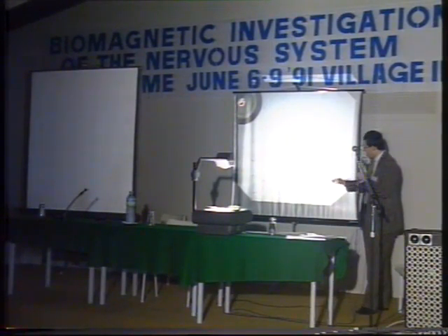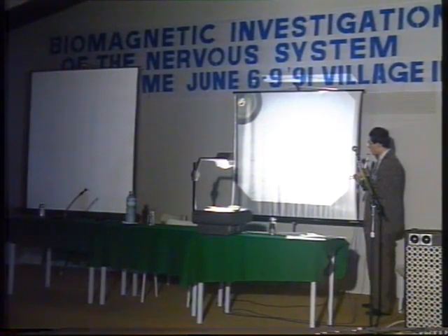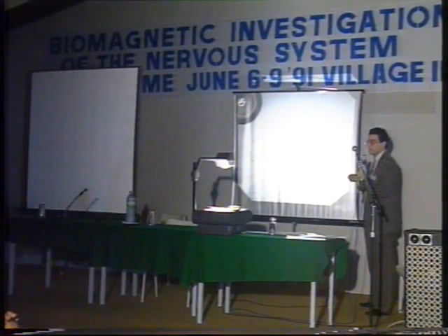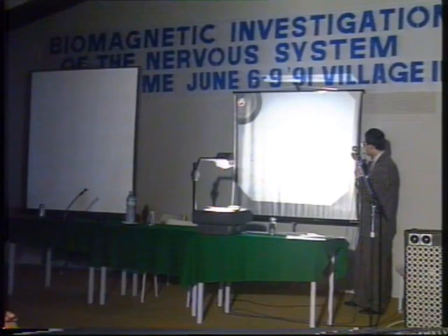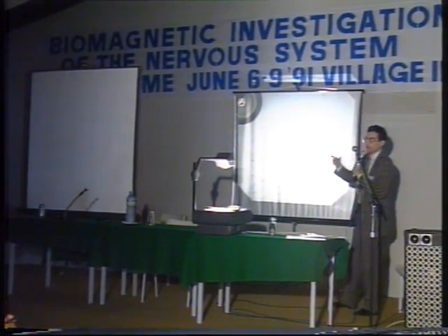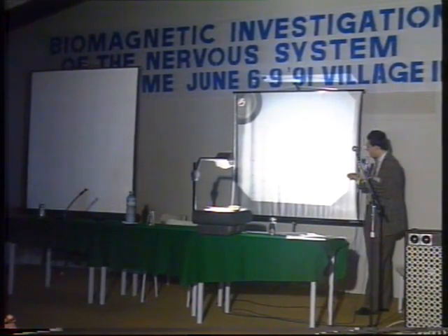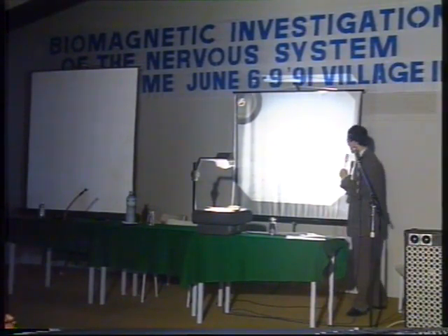After that, I can fit this ellipsoid where I can draw my maps. To localize this activity, I have to fit a sphere inside this ellipsoid. And what I have to do is take into account that some points may actually not be on the sphere, but a little bit far because of the ellipsoid. So the map here is drawn on an ellipsoid, but the source localization procedure is done on a sphere.